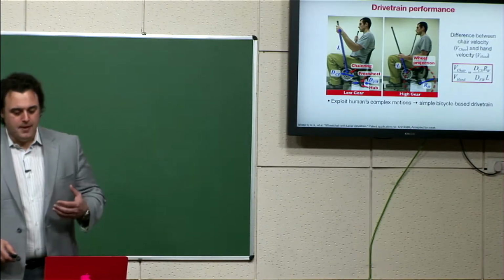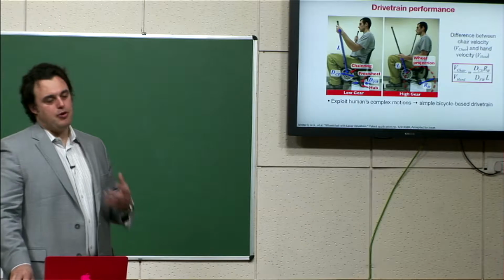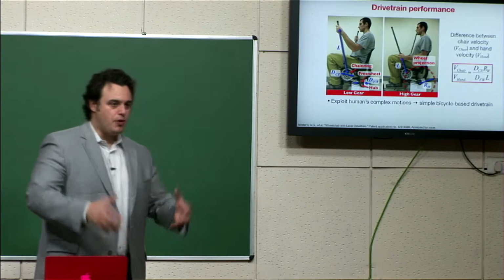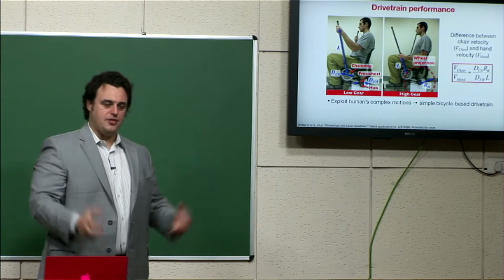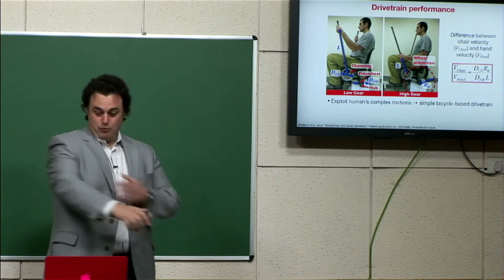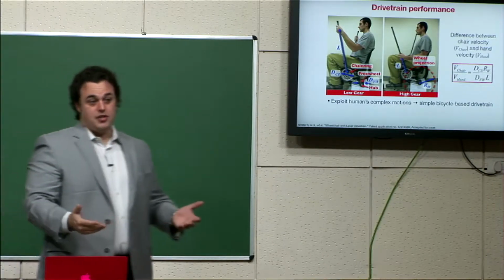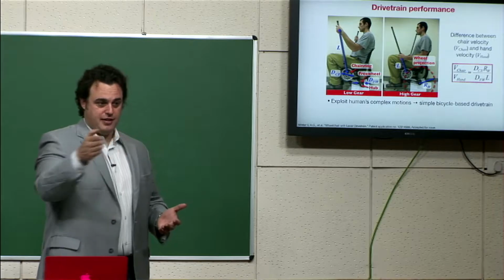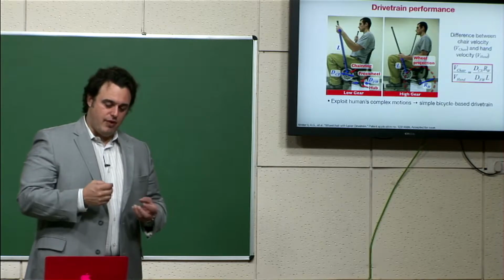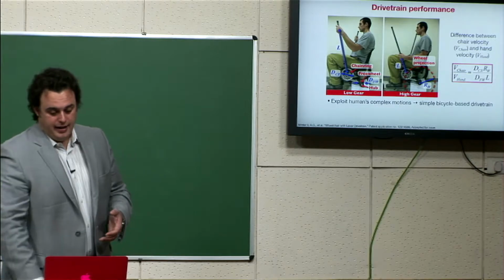And it enables us to do a number of things. One, we were exploiting a natural motion that a person is able to do, and as a result could have a very simple mechanical system. So a person can very easily grab at different points on a lever. We don't even have to think hard about it. But think about a mechanism that would replicate what your arm is doing when you're grabbing. On a regular bicycle, what does that is a derailleur. A derailleur is what shifts the chain to different cogs. The problem with a derailleur, particularly in a resource constraint setting, is it's a rather fragile element, and they're also quite expensive when you buy them in developing countries.